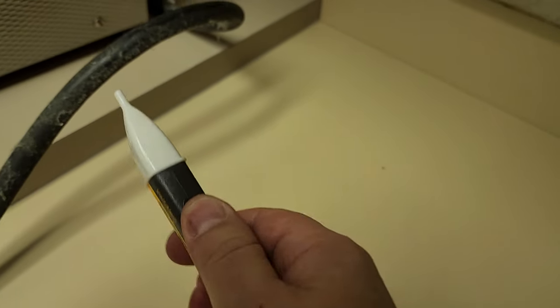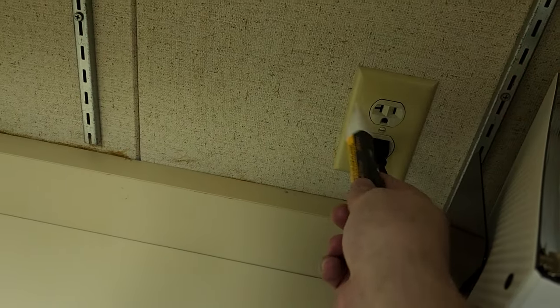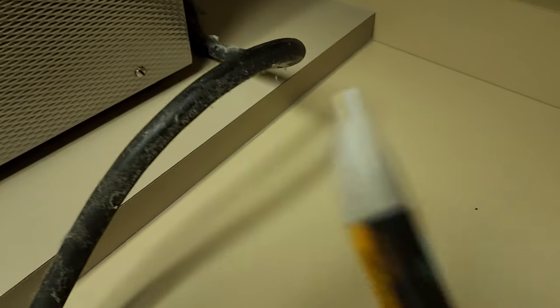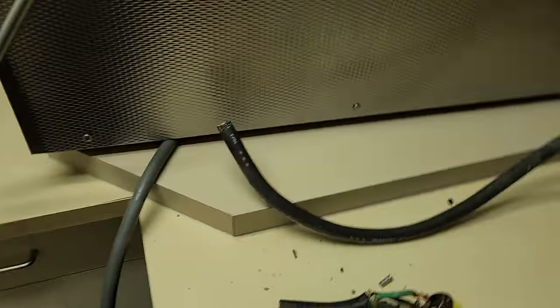And the mysterious thing is that I come in, I got my chicken stick right here. All right, so I come in, verify the chicken stick works. Look at that. Boop. I don't even have to get close because this is an ultra sensitive, the 20 to 90 volt. And I came in here and on the power cord, I had nothing. I was like, all right. So then I pulled the power plug back just a little bit and I noticed it was a little bit crunchy and I had nothing also right here at the wall. Like it should be glowing, all right? So I had nothing. Okay.